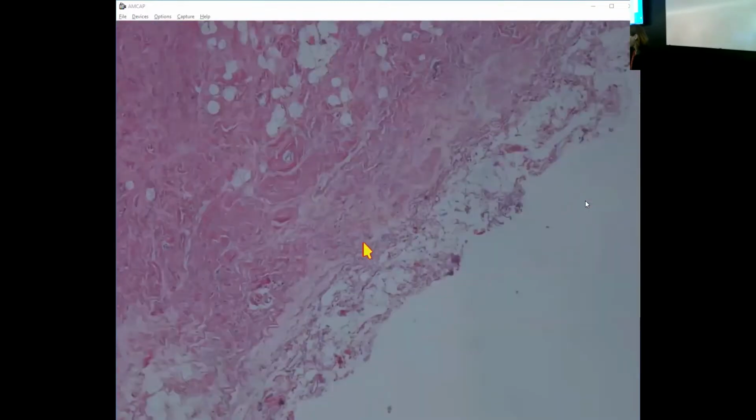And you know, the very dense pink fibrotic stroma, I should have brought a case of carcinoma with that. You can get cancers with that very dense pink sclerotic stroma, but they're the more unusual cancers, I would say. It's not uncommon, but as I've stressed, I would always start from a place of benign with that kind of stroma, unless it's really obvious invasive cancer. So that tends to be my approach with that.